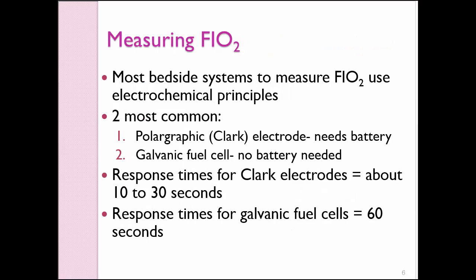decisions. Measuring the FiO2. Most bedside systems used to measure FiO2 utilize electrochemical principles. The two most common are number one, the polarographic electrode, also called the Clark electrode for the guy that invented it, and number two, the galvanic fuel cell. The polarographic electrode requires a battery and offers a 10 to 30 second response time. The galvanic fuel cell requires no battery, but it takes some 60 seconds to offer a stable value. So with any of these that you're using, you may need to wait a little while until the numbers stabilize so that you can assure that it's an accurate reading.